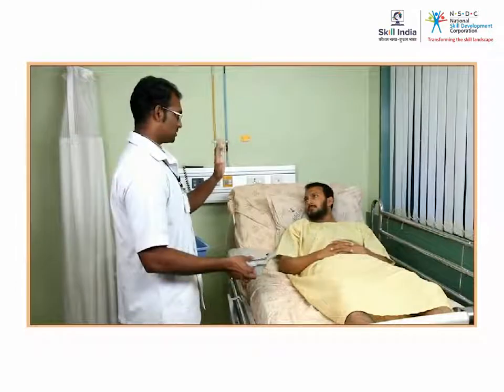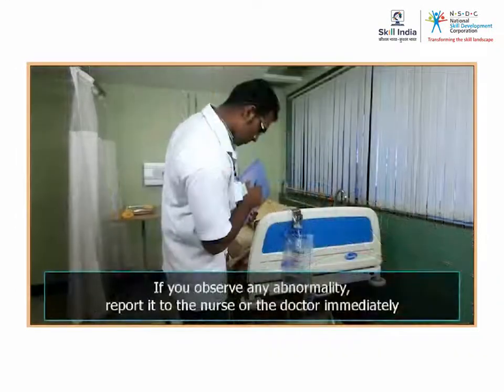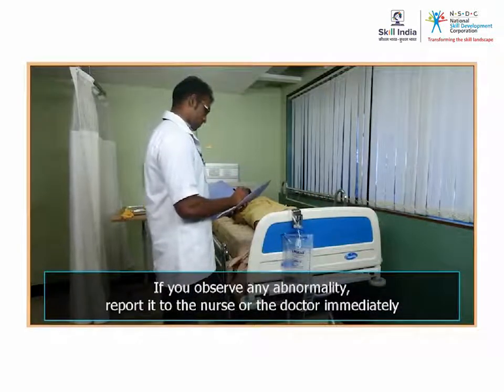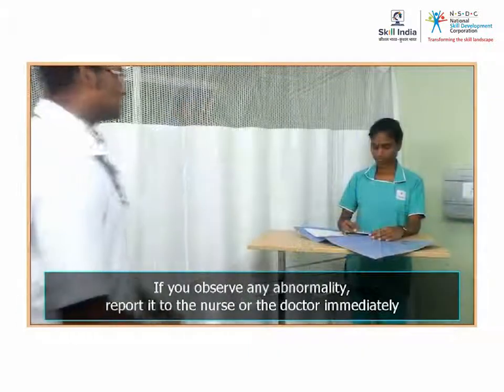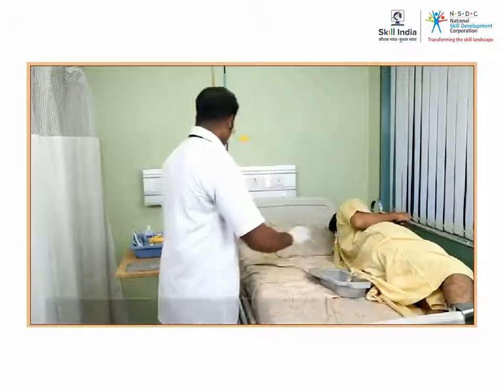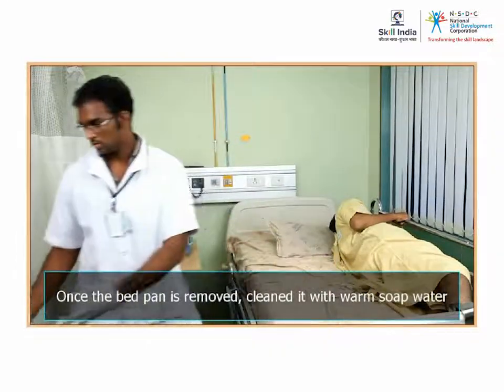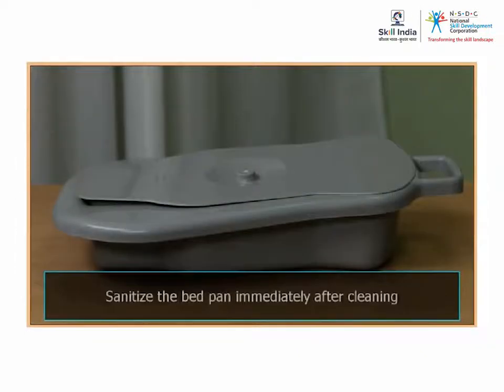If the patient complains of pain while urinating, or if you observe any abnormality such as bleeding while passing urine or blood in the fecal matter, report it to the nurse or the doctor immediately. Once the bedpan is removed and cleaned, fill it with warm soap water. Use a toilet brush to clean the pan thoroughly. After cleaning the bedpan, sanitize it immediately.